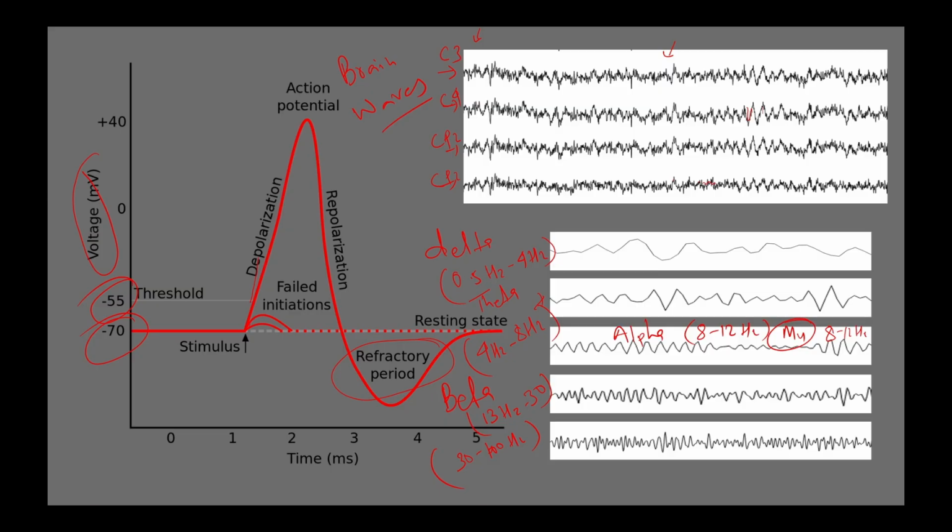This is how we analyze: we observe the behavior of the signal in certain frequency bands, like the delta, theta, alpha, beta, or gamma band. For example, suppose I want to study deep sleep.